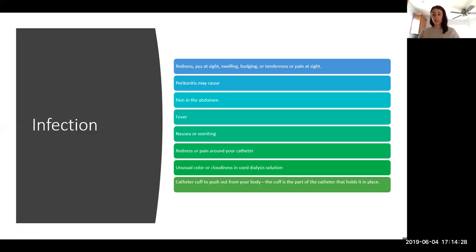But the fluid can actually tell you a lot. If it's cloudy or a milky color, which I never got to see, and I'm definitely glad that my patients with PD have not had this happen, but I have heard stories, and that can be a huge sign of infection. And they will actually have you send down a sample of the solution that was taken and see if there's an infection that way.